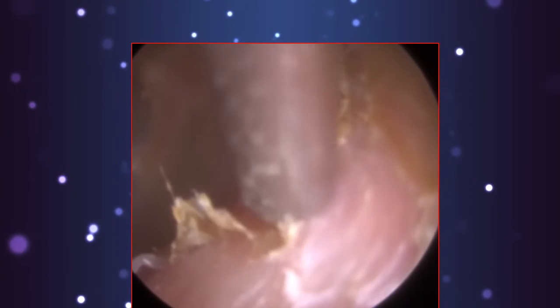So just gently lifting this off the base of the ear canal. I'm going to be really, really gentle. I don't want to touch the canal wall. It's like that game of Operation: the patient will start buzzing and, well, not be very happy if I do, because it will be very uncomfortable for them. So again, we're not going to be able to get every little aspect out. It's just not possible, guys. We're just going to do as much as we can as safely as possible.